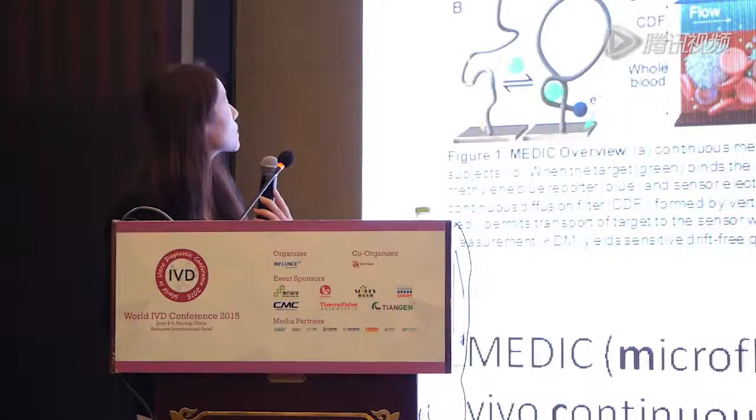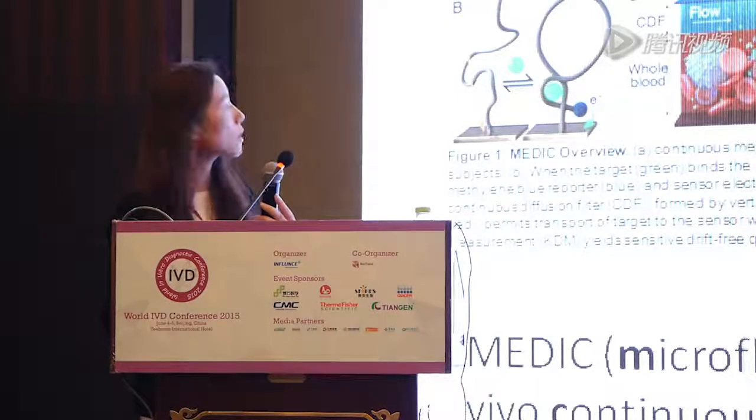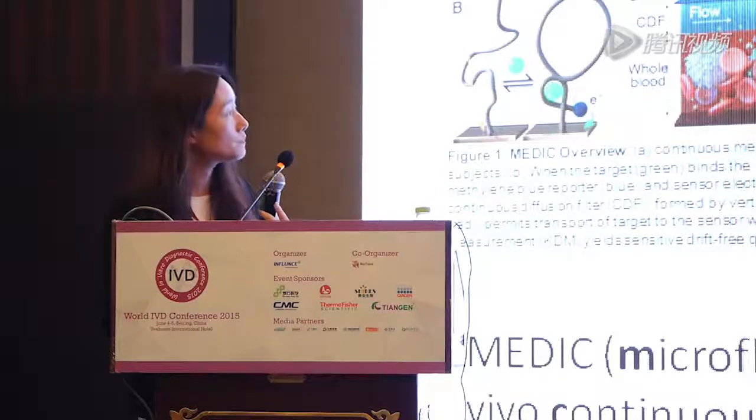Here, essentially, it's a device that you can connect to the patient's blood via the catheter. And then the blood will flow continuously through the device. In the interim, the analyte in the blood that you are interested in, in our project, is propofol, an anesthetic used a lot by surgeons or anesthesiologists during operation. Propofol will be monitored by a specially coded aptamer on the surface of the device, and that will give you a real-time readout of the propofol concentration in the patient's blood. In this way, the anesthesiologist can view the propofol concentration in real time and continuously during surgery, and therefore they can minimize the adverse effects caused by overdose or underdose, for example. So here just shows the aptamer generation process.